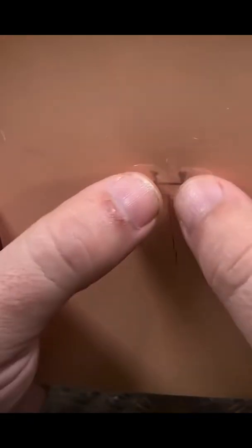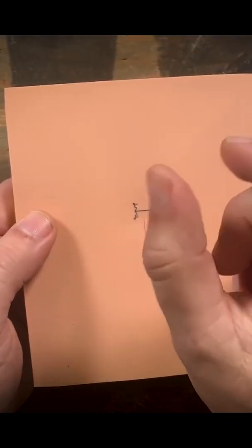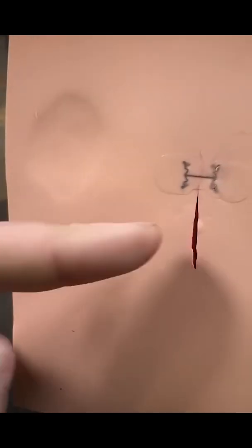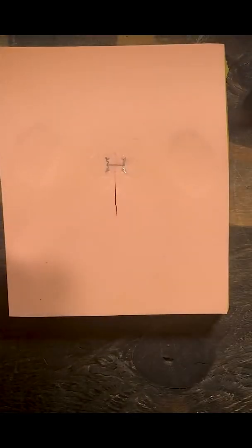The staples are in which is going to help you keep it tight. You can see it kind of separating a little bit up at the top, but it holds it together. So we'll put one more on there.